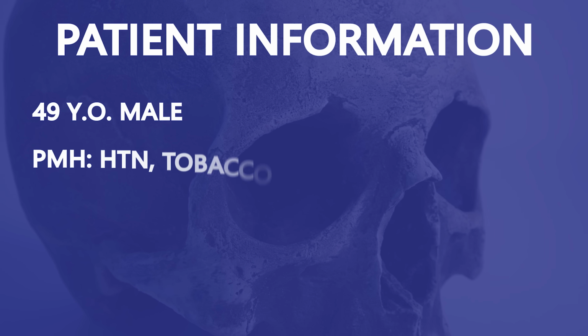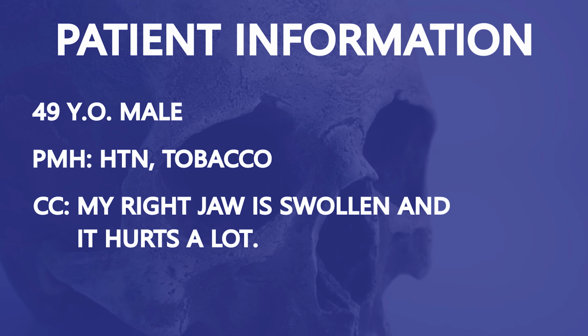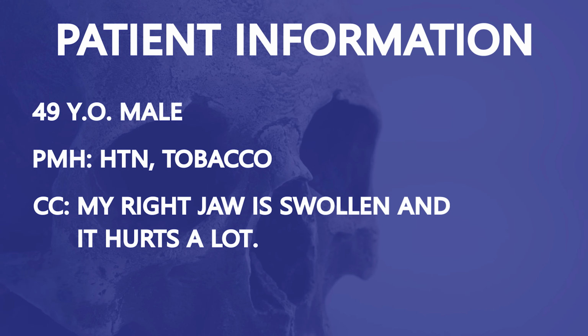Today we're draining a big dental infection. This patient is a 49-year-old male who has multiple dental needs. He has generalized carious lesions, and in addition, he recently fractured a bridge in his right mandible.